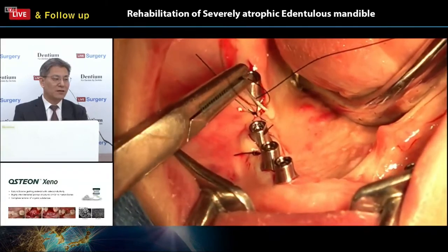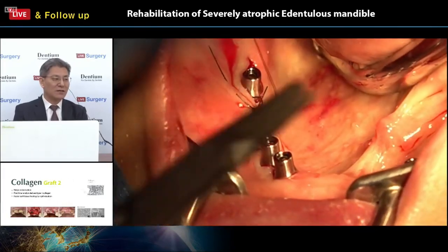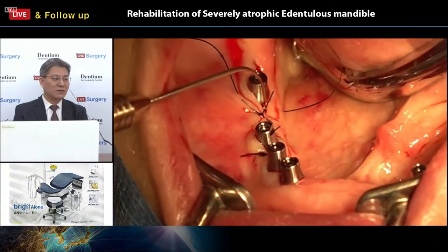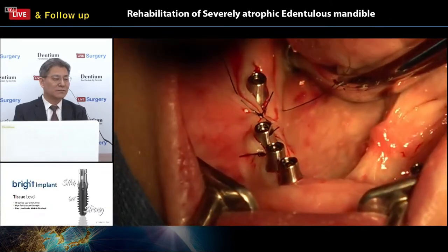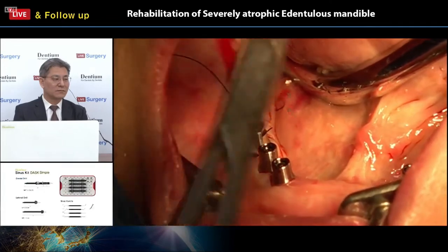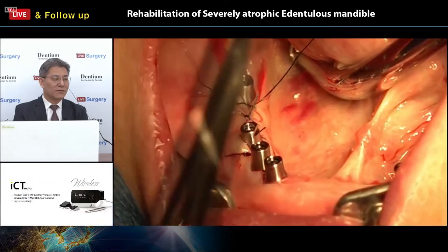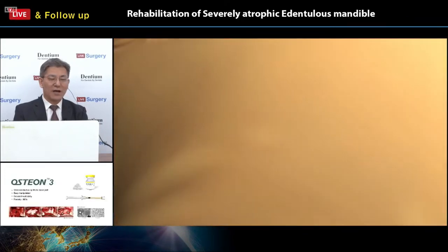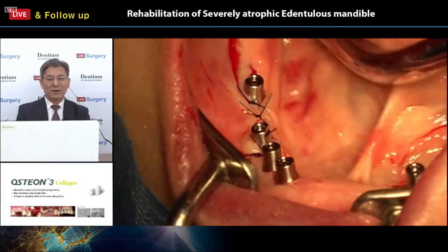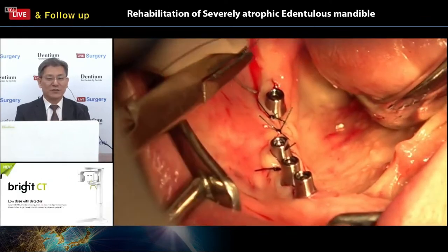Okay, I think the stitch is almost done, the final stitch, the final sutures. So, very well done. The installation with higher initial insertion stability, with almost perfect, actually, I want to say perfect position, perfect angle.